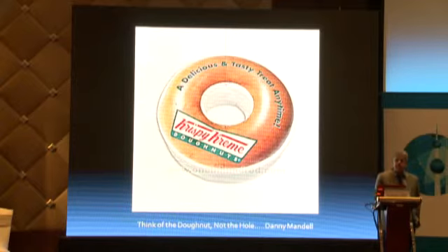So his question was about high resolution T1 images for identifying dissection. Yes, you do that, but in this case I did not do it. And that's how you would evaluate. And in fact, the next topic is on that only.